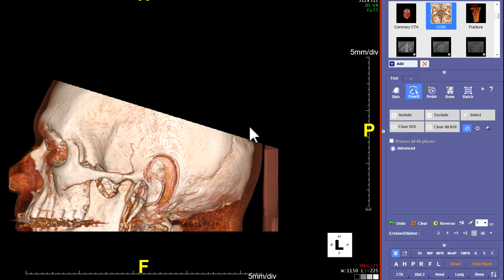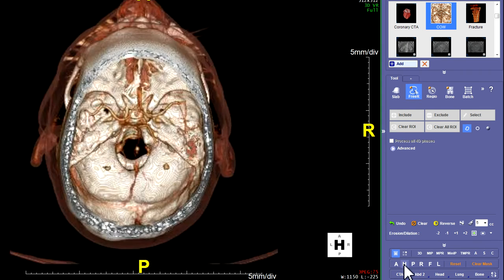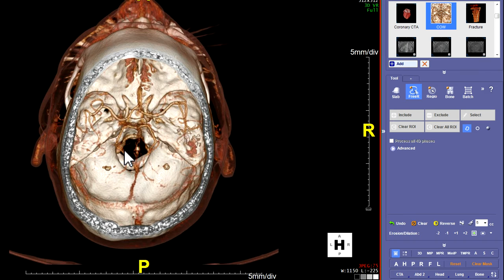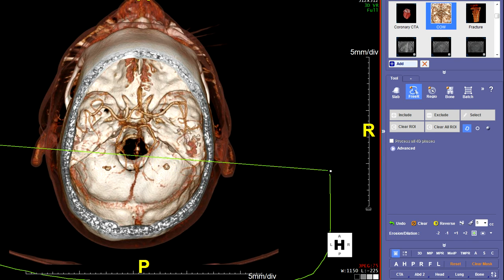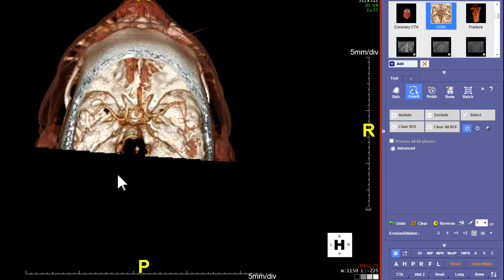Now we're going to cut off the back of the head, which we'll do from the head view. Click the H and now we have the head view. Try to see where the vertebral arteries come out of the bones back there — we're going to cut everything from there back. Take your arrow, go basically straight across, then left Shift so it turns into a little dot, go back and cut everything off, bringing it right up to the back edge of the vertebral arteries, right where those verts come out of the bone.